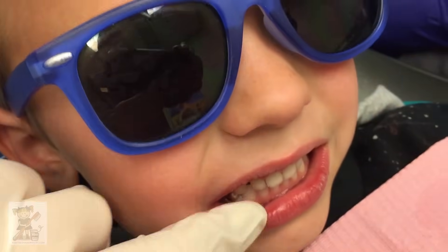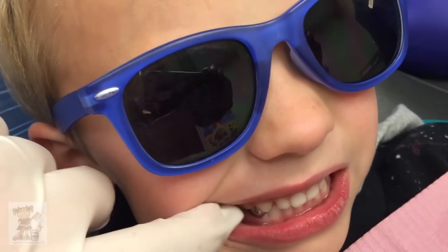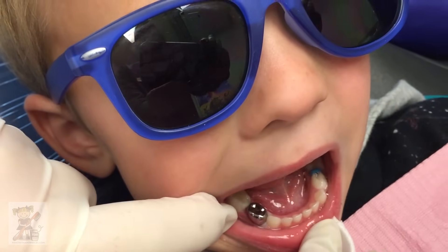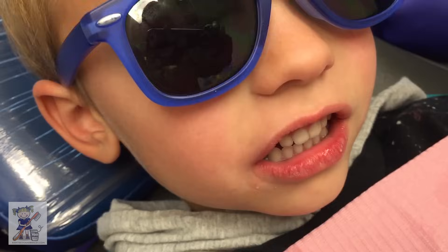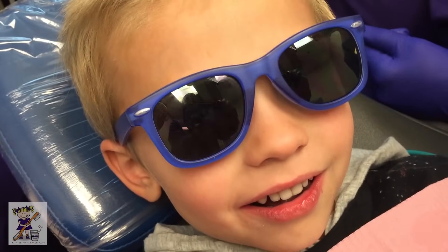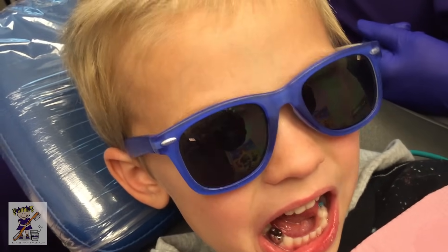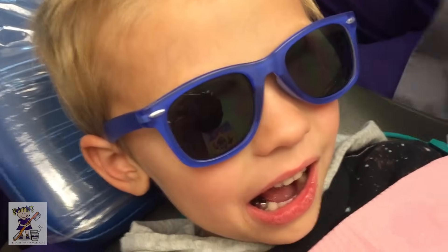I see a little bit more cement. You're such a good biter. Did I get all the glue out of there? Gorgeous. You did it. How was that? Was that easy? Thank you for helping to teach all the other kids. We'll do the other one next. Is that cool? Let's just keep going then. He's excited.